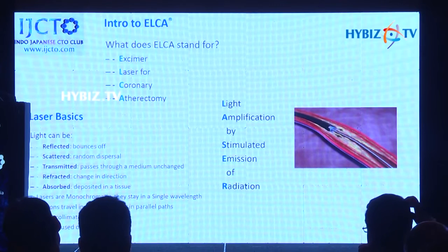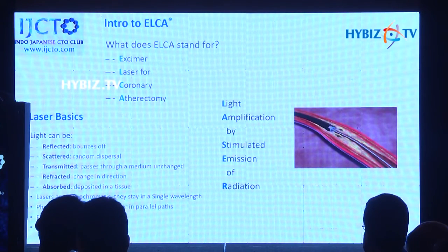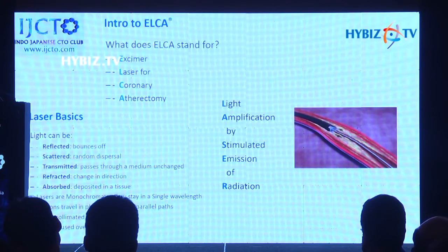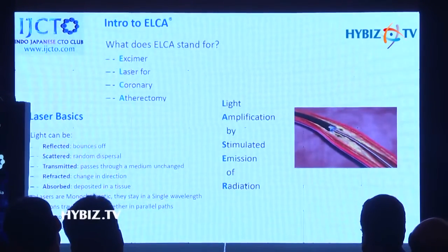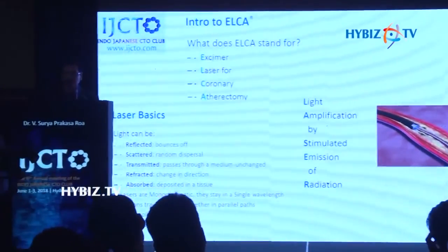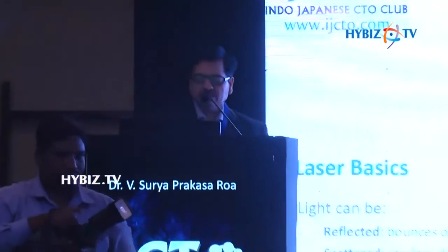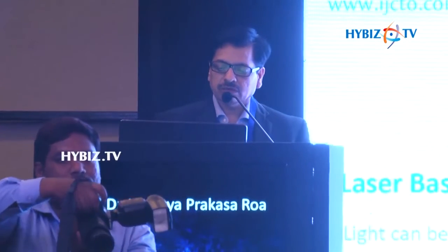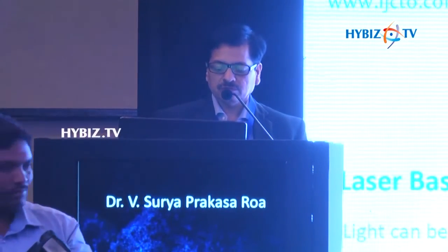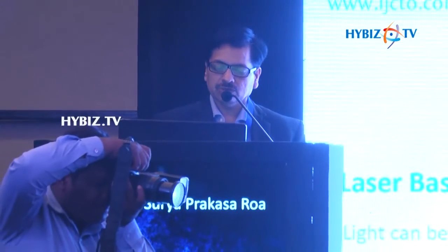So next is the excimer laser, which is already explained by Dr. Keshav. In some of the cases we have seen the wire cross, but nothing was able to cross, not even a 1 millimeter balloon, and this is one hope, where you need not exchange the wire to a Rota wire. That is the advantage here. But as you said, in coronary the studies and registries are still going on, and there is not much experience with this either, but most likely in the coming months we may be doing this in CTOs with uncrossable lesions.